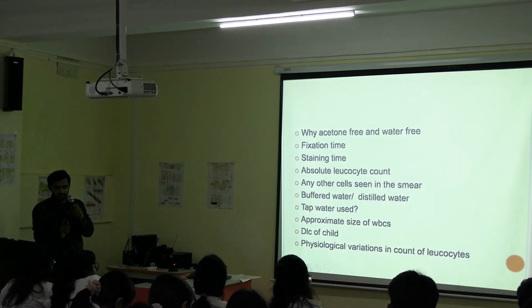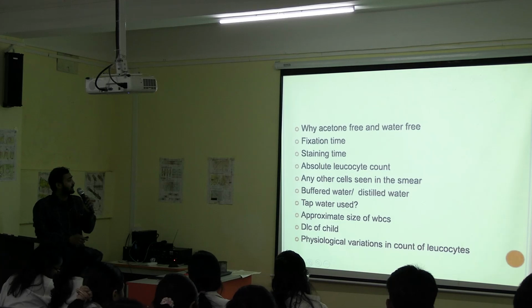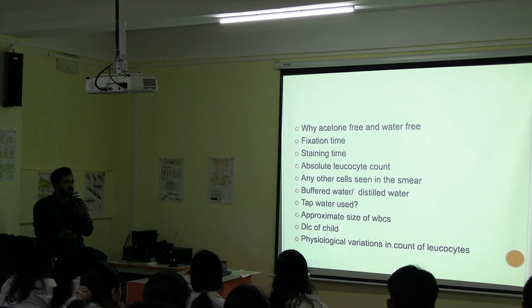Yes. Total count is also known as absolute leukocyte count. And what are the other cells you'll be seeing in the smear? Okay. Other cells? What other cells can you see? Other cells other than blood cells.